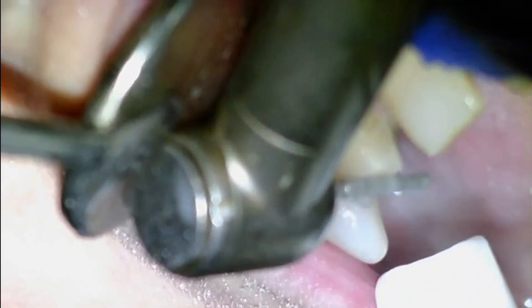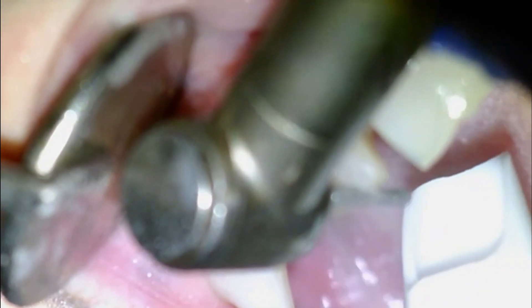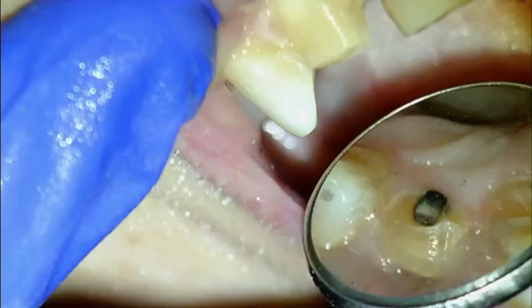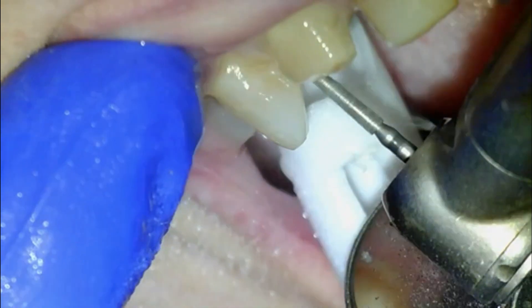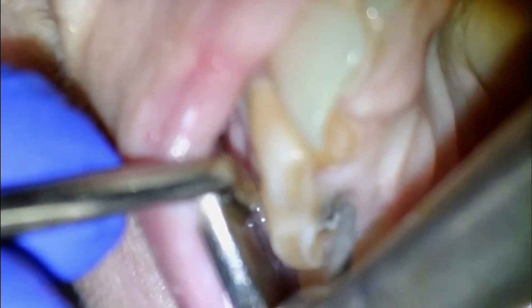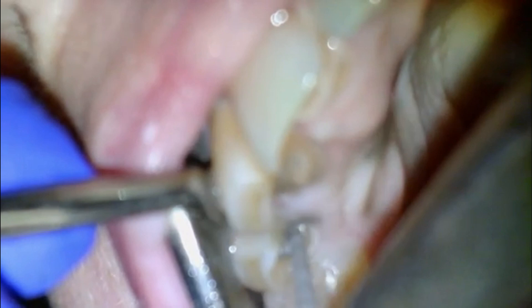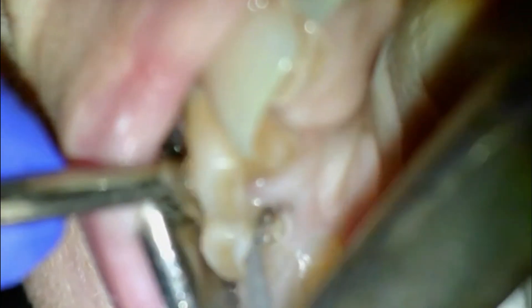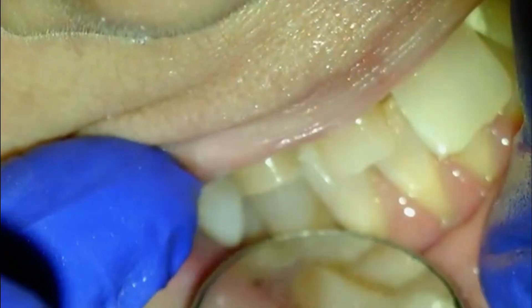One plane is the lower one-third of the tooth. The next plane is pretty much the second two-thirds. The third plane — and this is something I learned from an older dentist that does a lot of cosmetic work — is just the tip of that incisal edge. What that does is make sure you're never leaving a sharp corner on the edge. You never want sharp corners in your crown preps because that will concentrate stress every time they bite — street curbs are always rounded for the same reason. We're also removing some amalgam off the back of tooth number seven, which is the only tooth we're going to do any kind of buildup on.